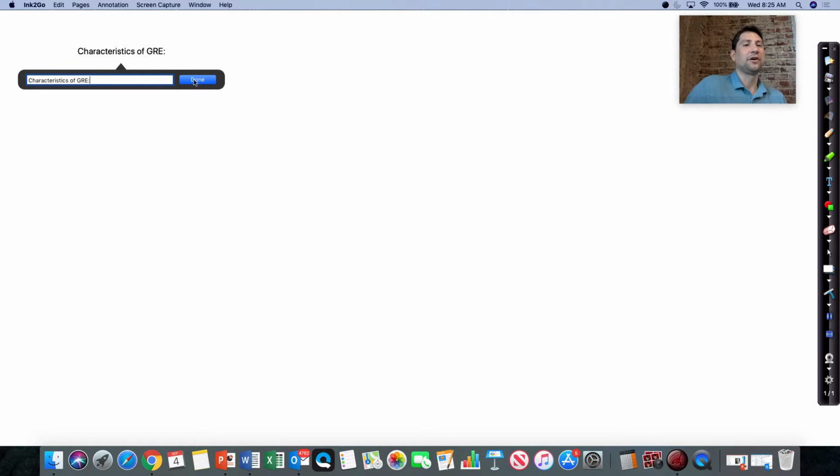What do you think GRE stands for? I keep typing that, but I was waiting for somebody to ask what GRE stands for. It stands for gradient recalled echo.